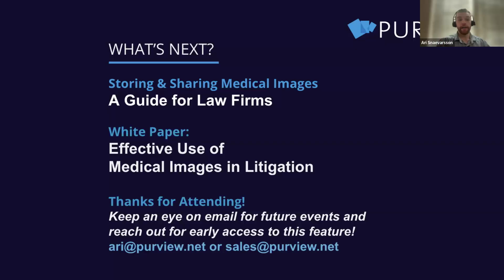Yep. Great. Well, I think those are the questions we had. So we've got a little bit of information about what's coming next, and let's tease this, but we are going to have some beta testing, so to speak. If you want early access to this, shoot me an email. I've got my email written at the bottom here. It's ari@purview.net, or you can reach out to the sales team in general. It's sales@purview.net, and we're happy to help you and make sure it's a fit for your practice.